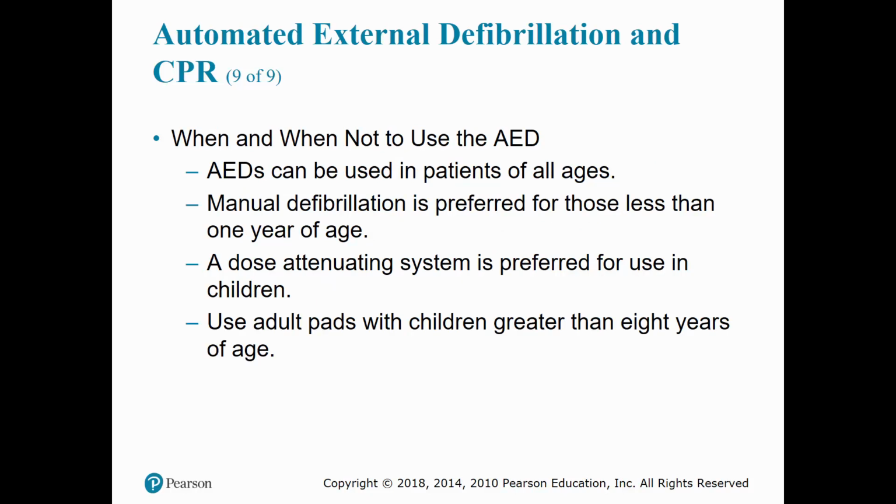When and when not to use the AED. Okay, AEDs can be used in patients of all ages. Manual defibrillation is preferred for those less than 1 year old. A dose attenuating system is preferred for use in children. Use adult pads with children greater than 8 years of age.